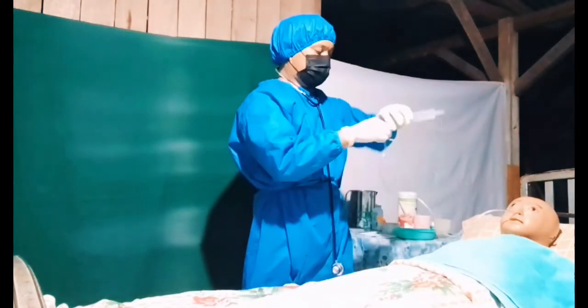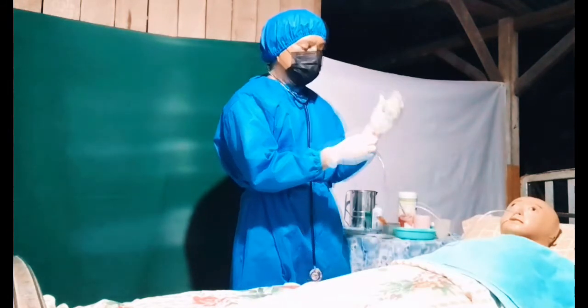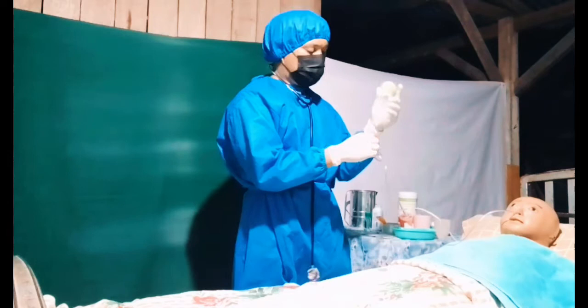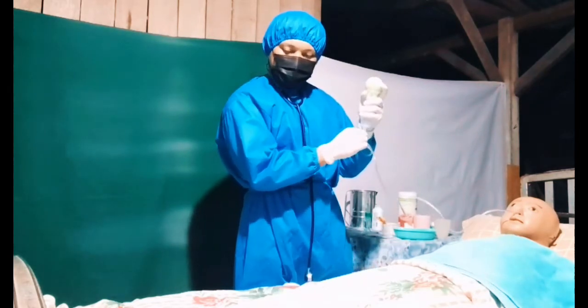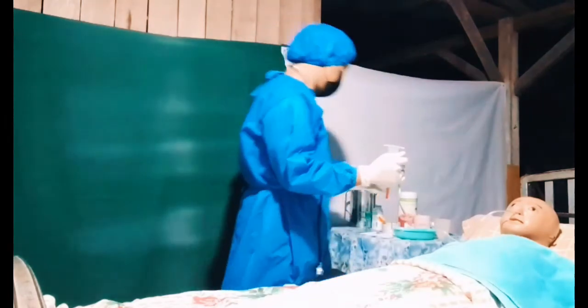Put the asepto syringe to the tube. Make sure that you always lock the tube to avoid unnecessary or unwanted air going inside the tube. So, remove the valve.